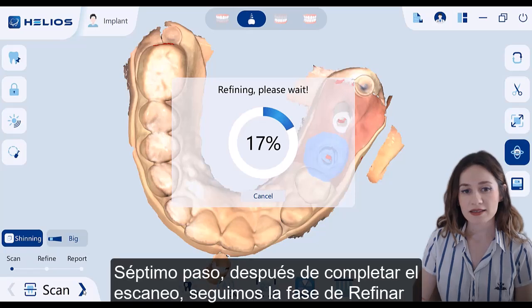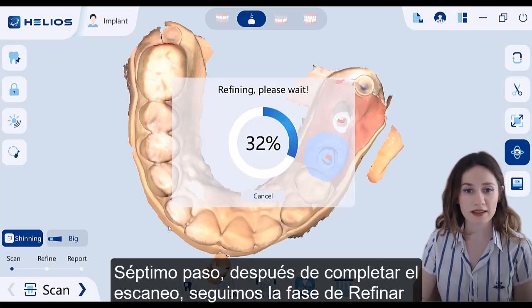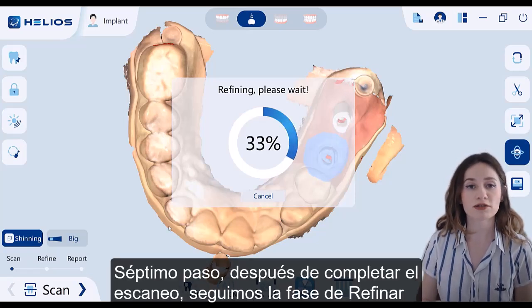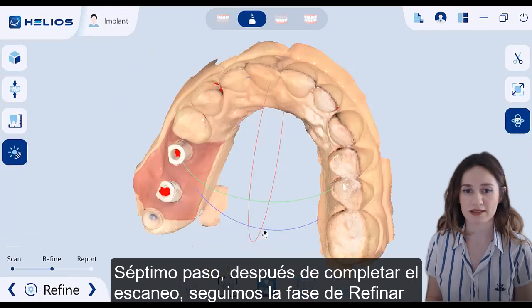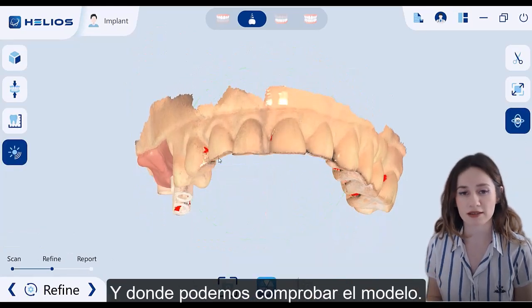After completing the scanning, we follow the refine phase where we can check the model.